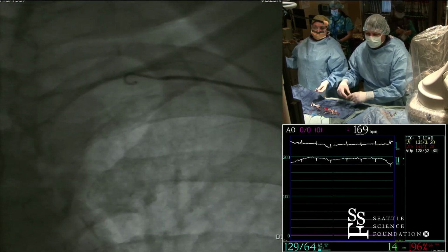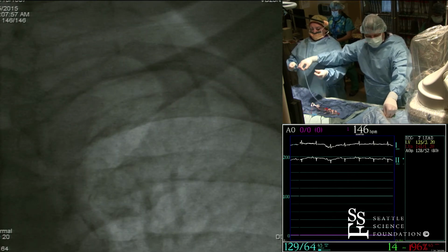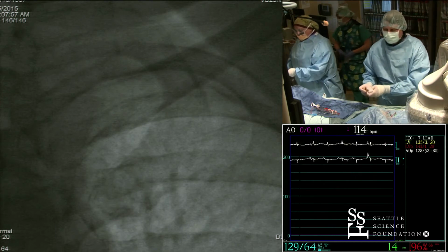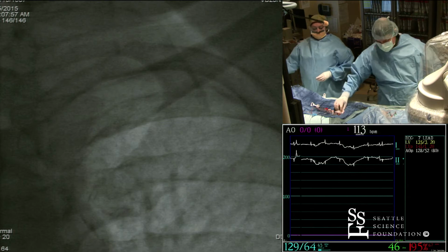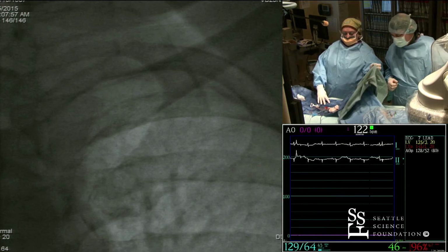So again, I think there's a difference of opinion. Pigtail, obviously, you're going to take out over wire, curved. An R4, I would not necessarily do that. I mean, I think if you get any resistance, it's a different story. Yeah, I thought that once too, Jeff, and then I got caught up in a radial loop that I didn't know about. So really, as you were pulling the catheter back? It jammed, and there's all sorts of pain in the elbow and everything. Wow. Yeah.